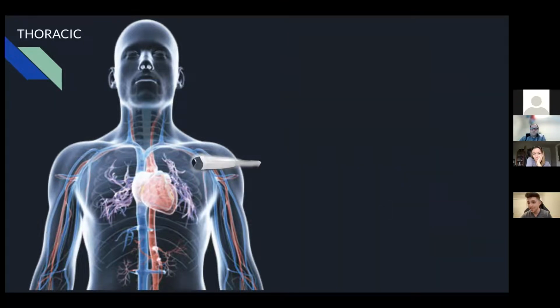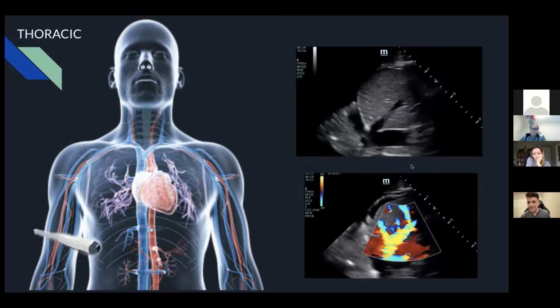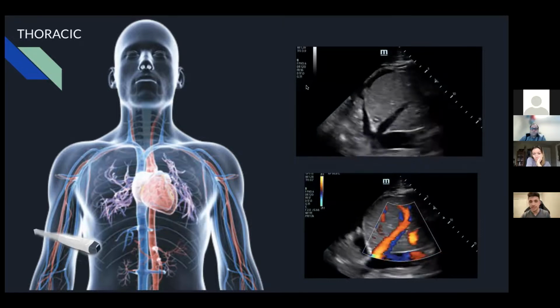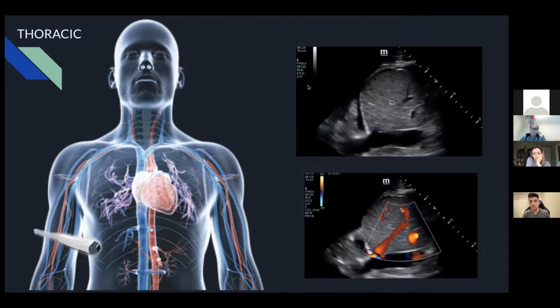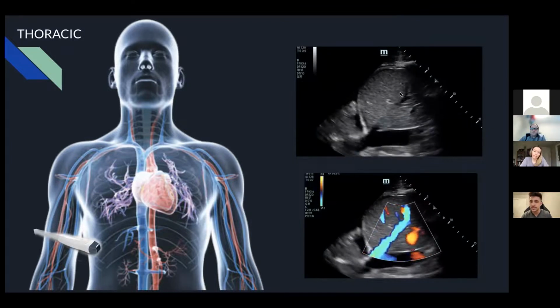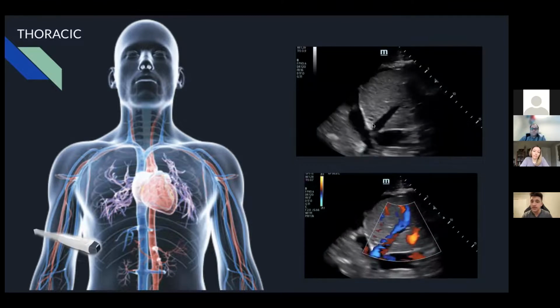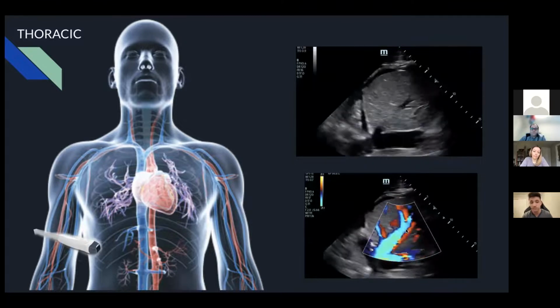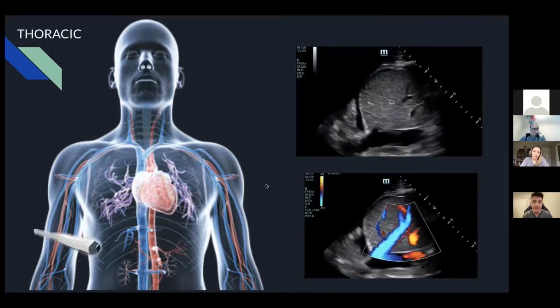Now, let's say you're doing a thoracic study. You start with the left side of the lungs, you move on to the right side, and then as you're in your costal space, this first image here, I think, does a great job of showing that if you just rock the probe a little bit south of the diaphragm, a lot of times you can see the liver, and you can see here, for example, a nice IVC and hepatic vein. You can put some color on there and we have great Doppler signal. So a lot of times that's another way we can integrate our VExUS study.